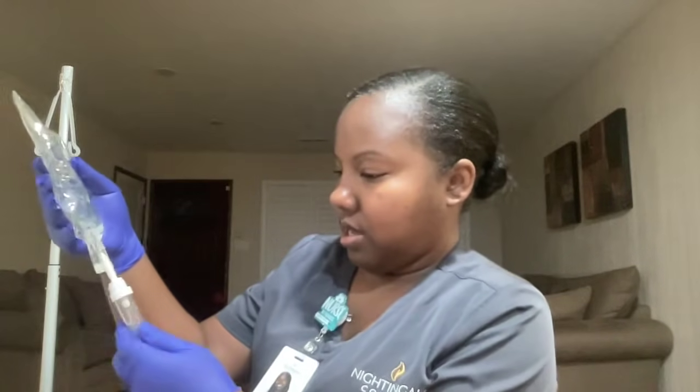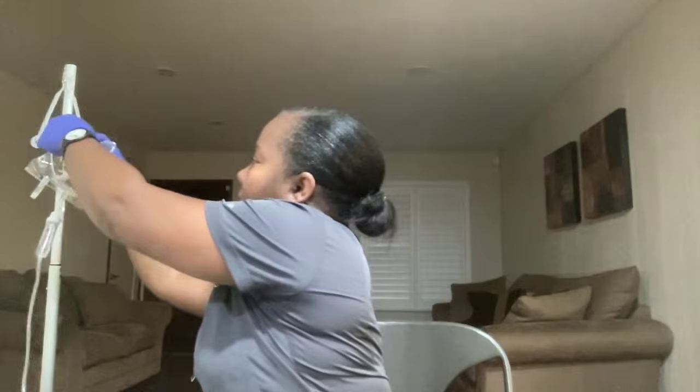Okay. And then we want to get some liquid in the chamber. And now we are going to connect this. As you see, I have placed it a little lower. Since I know I am going to administer medication, I'm going to place the medicine a little higher than the fluid. You have to place it at least 30 inches above the patient's peripheral IV site.